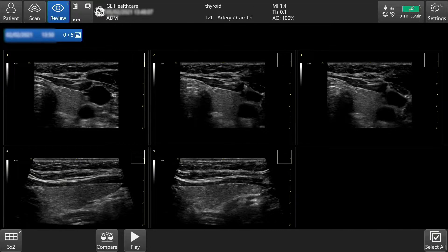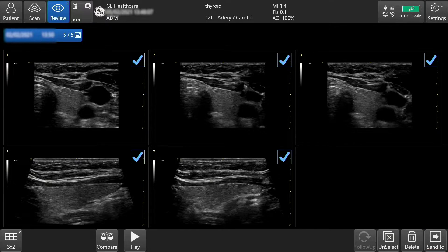If you would like to delete all images, you can also tap the Select All tab located on the bottom right-hand side of the screen. Now all the images are selected to be deleted.